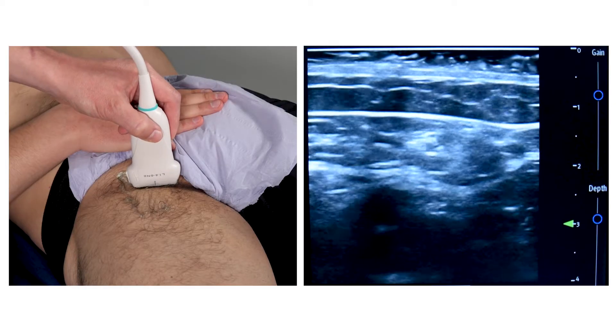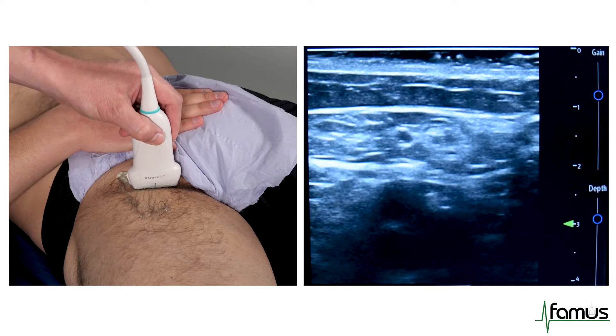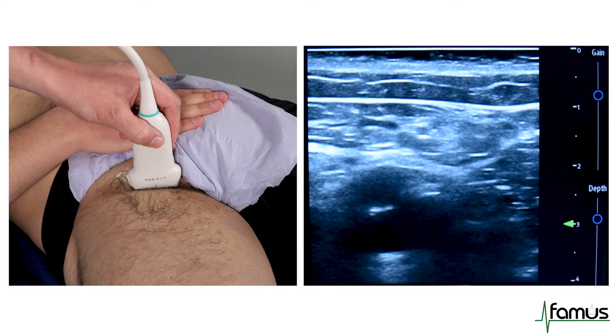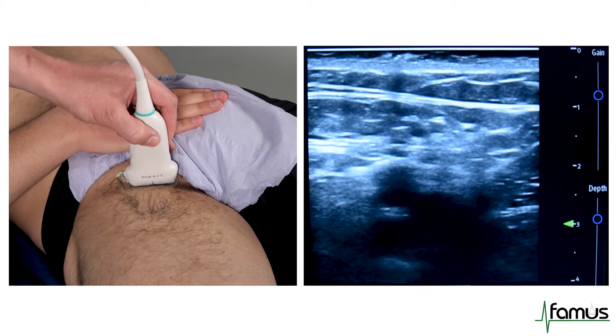We start with the probe in a transverse plane with the marker dot pointing towards the right of the patient. We place it in approximately the femoral crease. The most common pitfalls when people are starting out with DVT scanning are that the probe is not proximal enough and that too much pressure is applied.